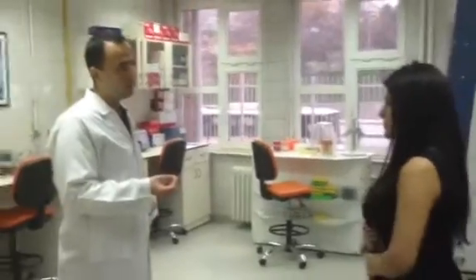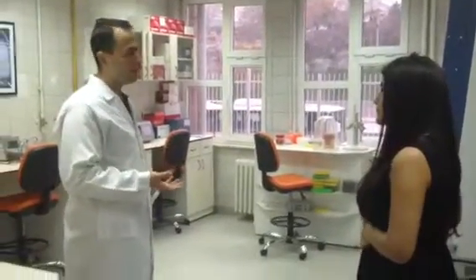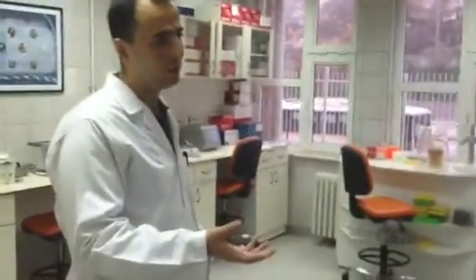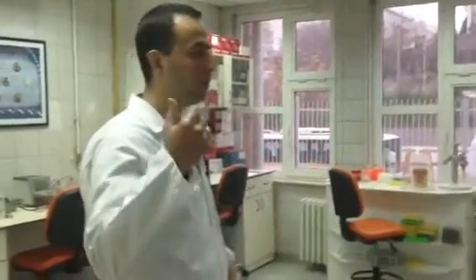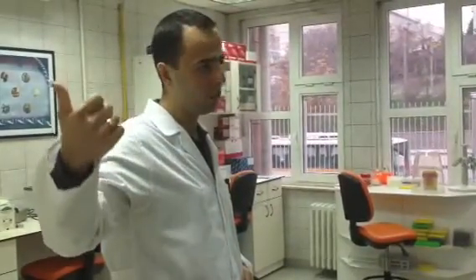This laboratory is the sequence laboratory. Sequence means the viruses or bacteria are determined by sequence analysis. There are different kinds of techniques in sequence analysis. Sequence analysis is very important for viruses. For example, a lot of viruses are in patients, and we determine, for example, the samples sent to the viruses laboratory.